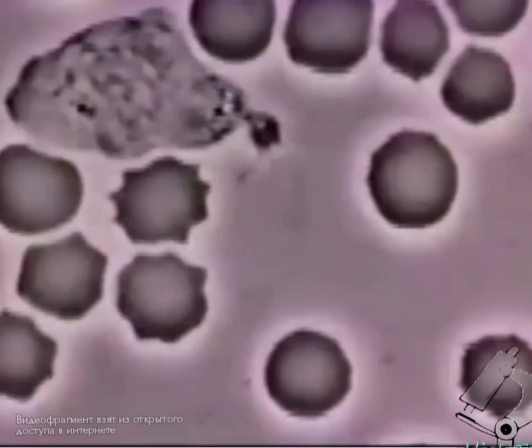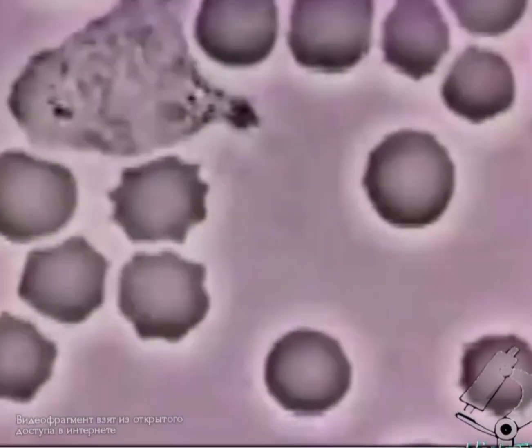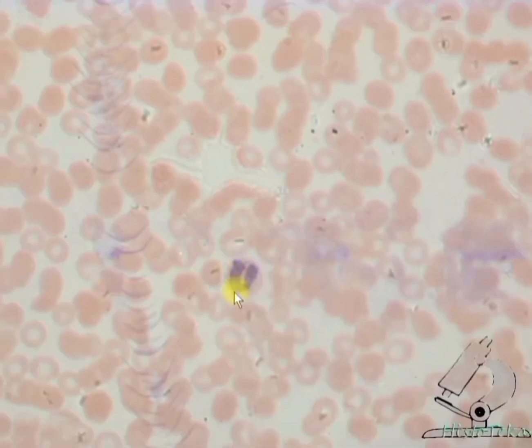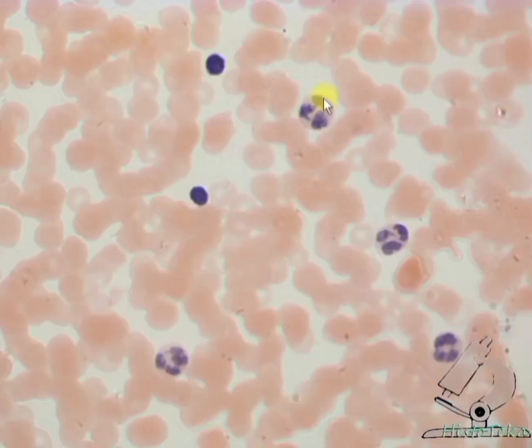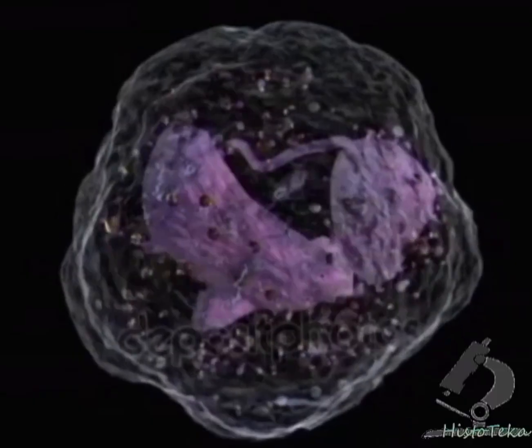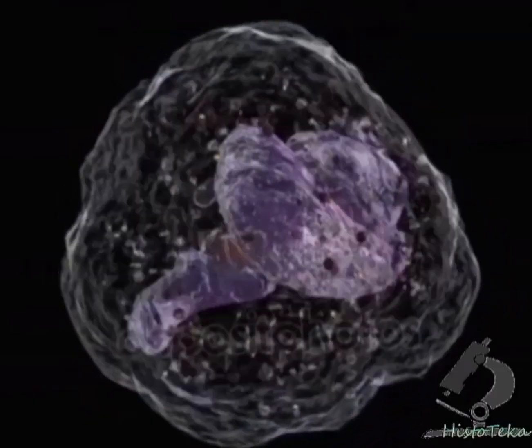The size of neutrophils exceeds the diameter of red blood cells by 1.5 to 2 times. Normally in the blood are present rod-shaped and segmented forms of neutrophils. The most numerous are segmented, 60 to 70%. Based on the name, their nuclei are segmented.